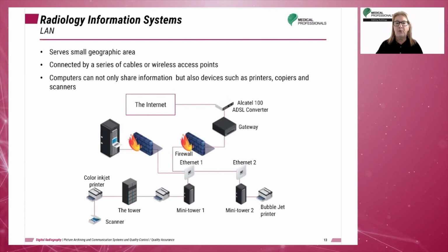Local area networks are the most common and serve a small geographic area, such as a single facility or building. Devices connected in a LAN typically share one server. The PACS for an institution is typically connected in a local area network, or LAN.